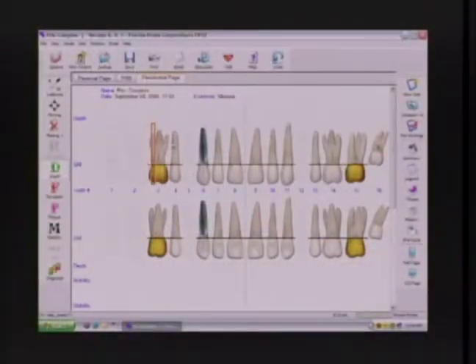That usually happens the first time with your first ortho patient, and the first bicuspid is gone, and you get to tooth 5 and it was really missing. It's a great shortcut to just reach over and hit delete. Okay? So it's not the end of the world. The cursor is now on the distal buccal of 3, and that's where we're going to begin the exam.